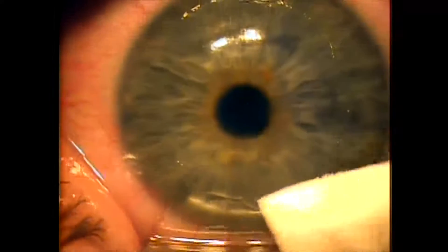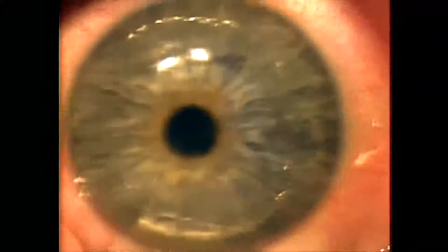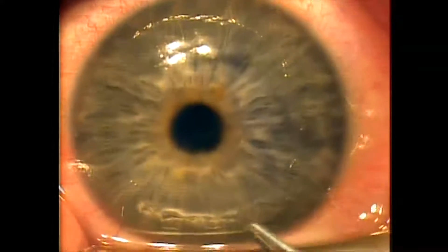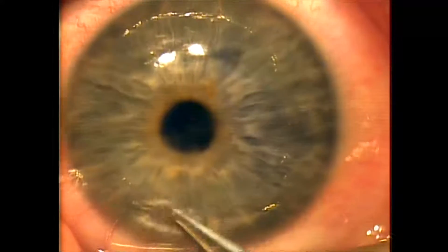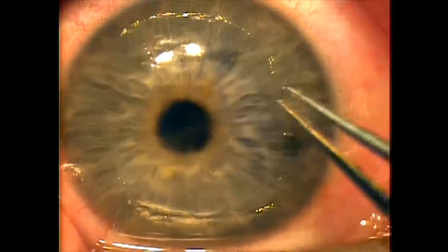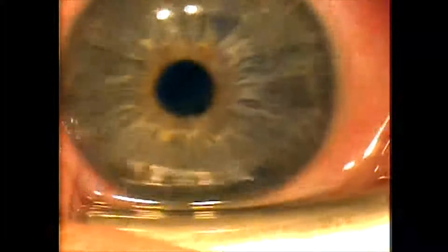This patient ended up doing fine, was very happy, and there was no further ingrowth of epithelium after this case. He was +0.75 before his touch-up, was plano the day after his touch-up, and then as the epithelium grew back underneath the flap he became +0.75 diopters hyperopic again. Once the epithelial cells were removed, his refraction returned back to plano. My indications for removing cells are change in refraction, discomfort on the part of the patient, or any type of visually significant epithelial ingrowth. This concludes the case — the patient did well. Thank you for your time and attention.